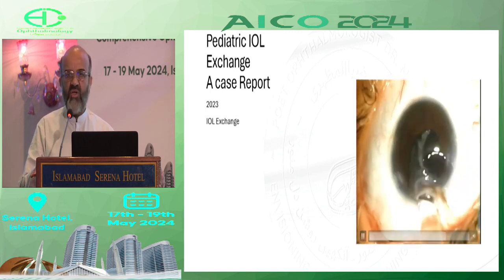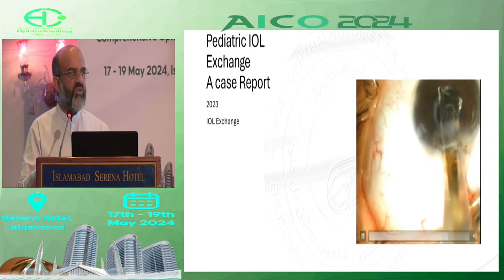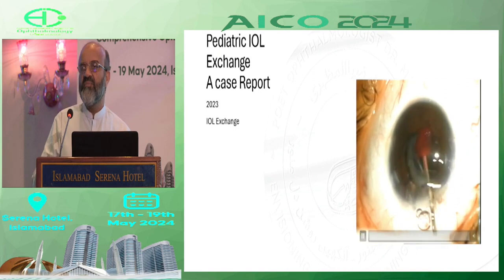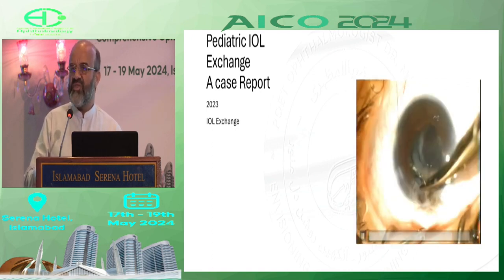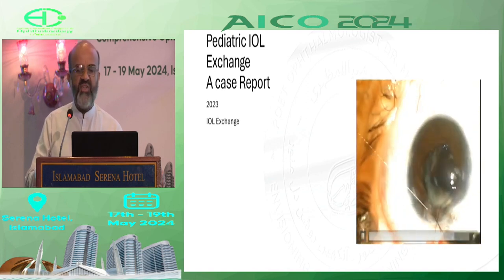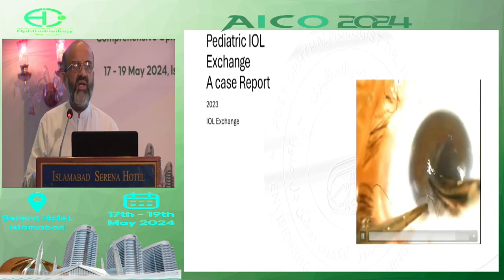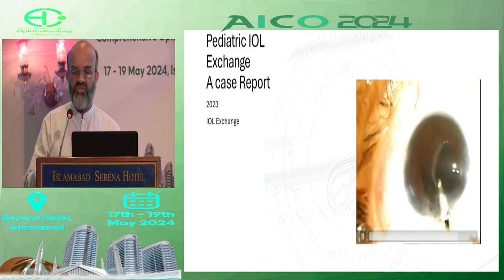And once the lens is out, the vitrectomy had been already performed. The standard procedure I perform in pediatric eyes is anterior capsulorhexis, IA, posterior capsulorhexis, anterior vitrectomy, and IOL implantation. So no other maneuver was needed. We implanted Acrysof multi-piece IOL in the sulcus, and I applied a cross stitch on the wound.